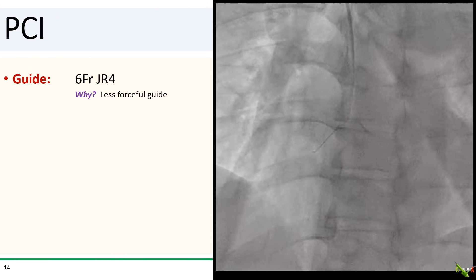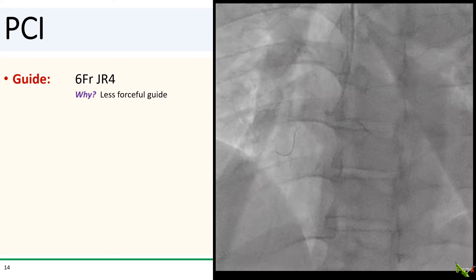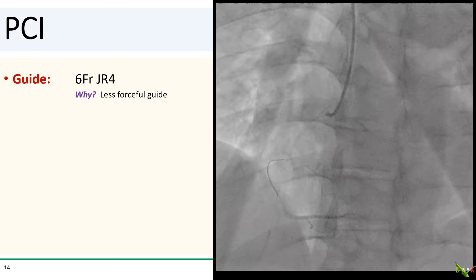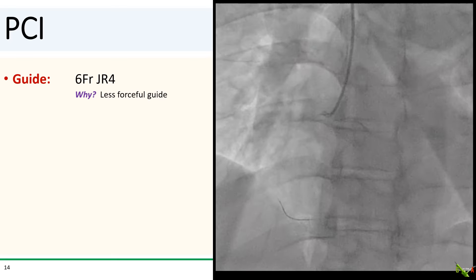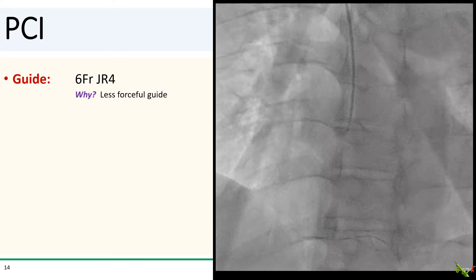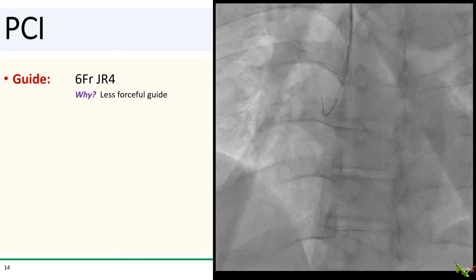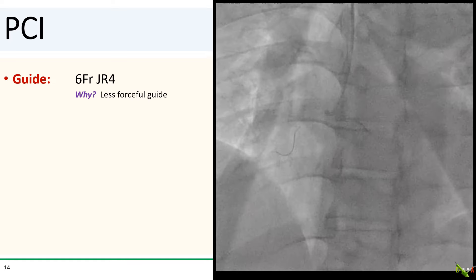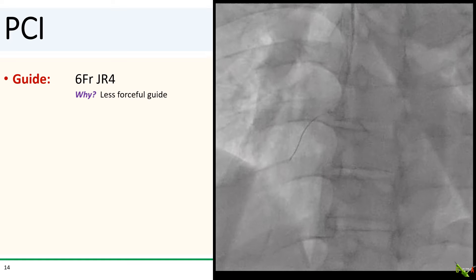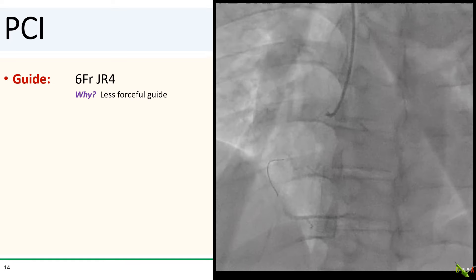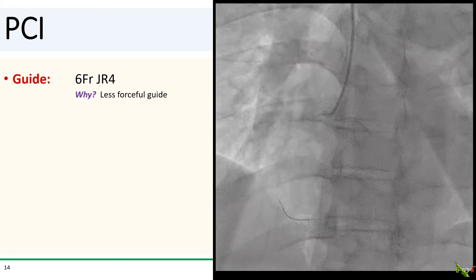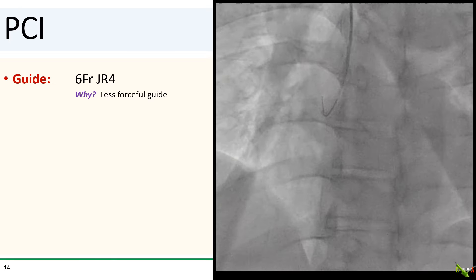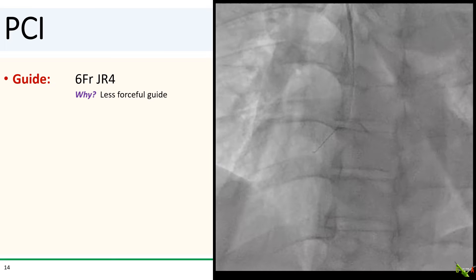PCI for SCAD — and for any dissection — is very different from regular PCI, and it can turn south very quickly, so I had to do this very carefully. I chose a JR4 guide. The JR4 is my standard STEMI guide for RCAs, and it's well suited here because the engagement is usually not deep and is less likely to cause further damage to the vessel wall. You don't want to choose an AL guide or a guide that will deeply intubate the vessel.